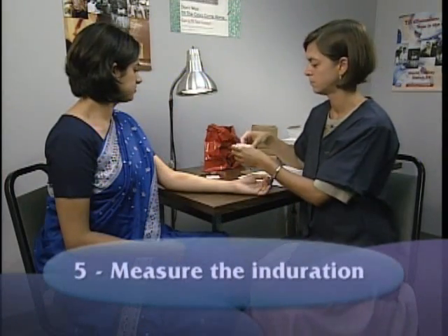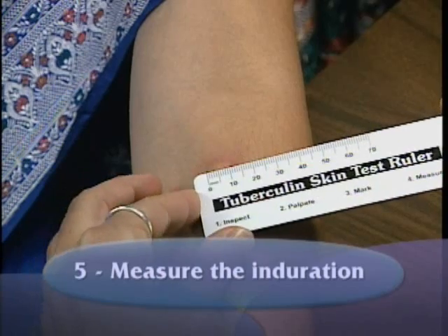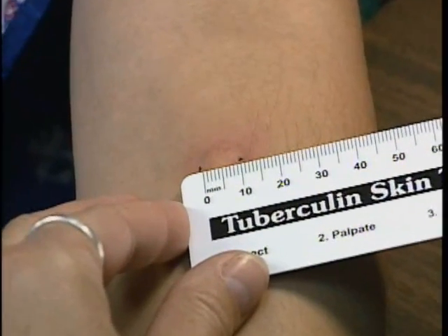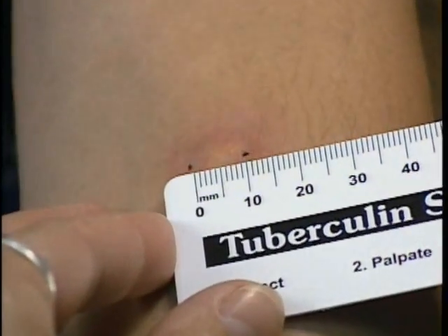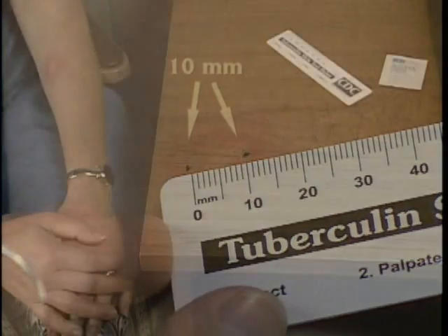To measure the diameter of the induration, use the millimeter ruler. Place the 0 ruler line inside the left dot edge and read the ruler line inside the right dot edge. If the measurement falls between 2 divisions on the millimeter scale, record the lower mark. The induration shown here measures 10 millimeters.